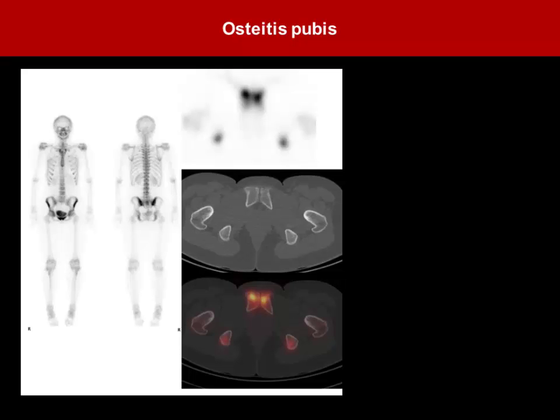Yes, that's the common. When I started my training, we used to do squat views. Now because of the time constraints, and we've got SPECT and all, we don't.